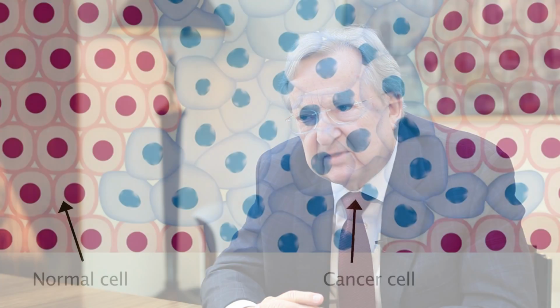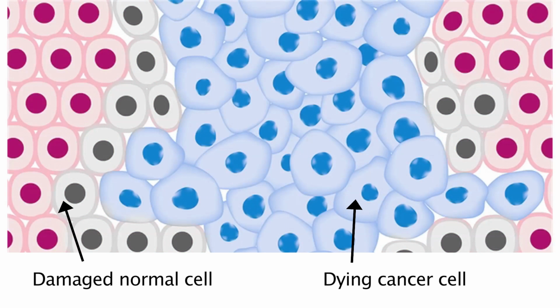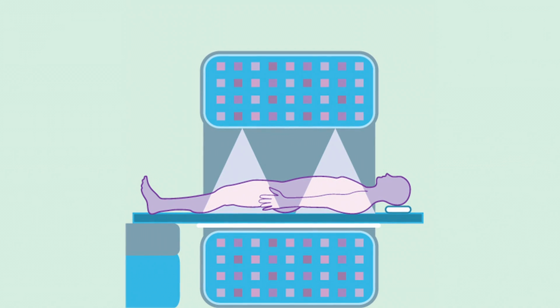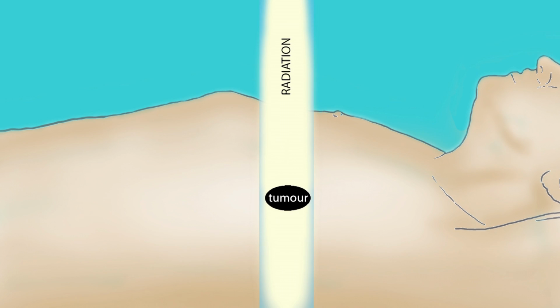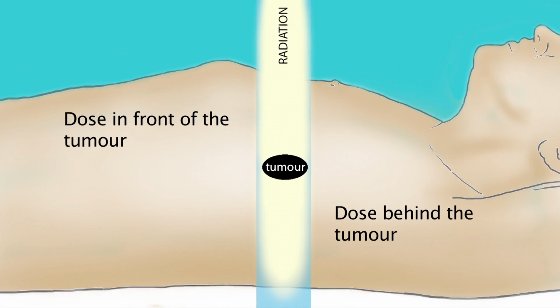X-rays and protons are not like a pill you take against your headache. These radiations are both so-called ionizing radiations, which in effect damage the genetic material of all cells. They damage cancer cells as well as healthy cells of surrounding healthy tissues. With X-rays, you always have a problem. X-rays can be targeted in 2 dimensions, up, down, left, right. But they cannot be targeted in the 3rd dimension, in the direction of the radiation, meaning it's a sort of shoot-through method. Imagine this to be the skin, and you radiate with your X-ray from here, and then the dose of the X-rays goes deep down into the body.